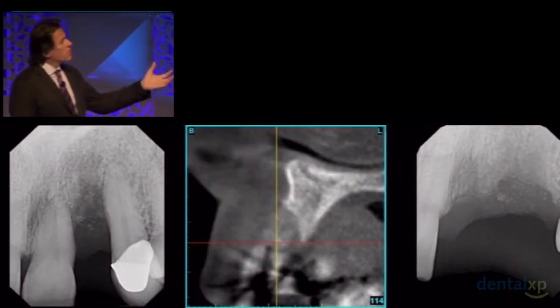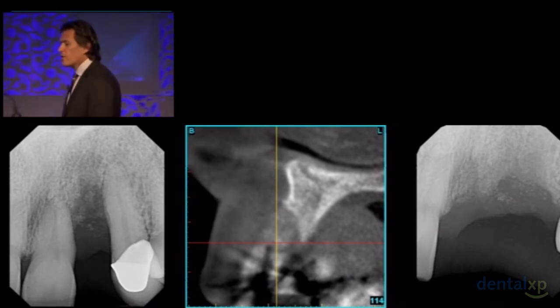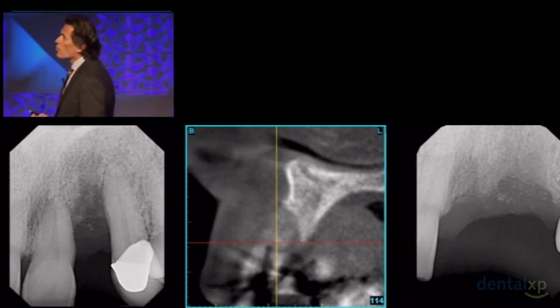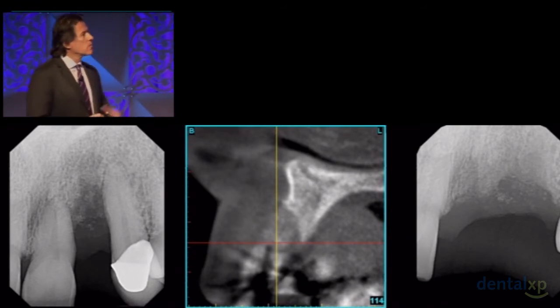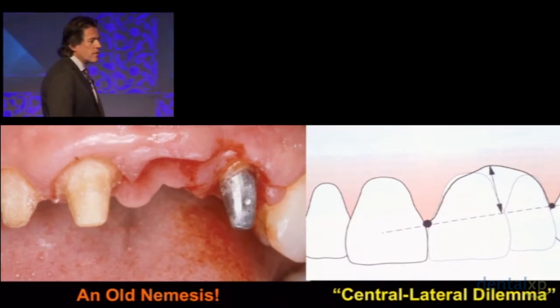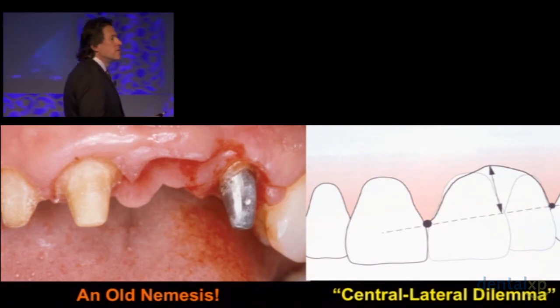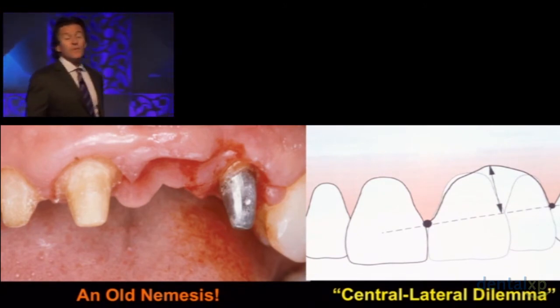And you see where we started, and the central image is the CT scan on the far right, the early healing of that putty bone at 4 months. And you can almost see how that bone is starting to resorb, and really thinking about it maybe in 7 to 8 months, somebody or myself having to go back and place implants. But let's talk about this, because it's not a new challenge. We think about this and say, oh, you know what? It only existed in the age of implant dentistry, but it did not.